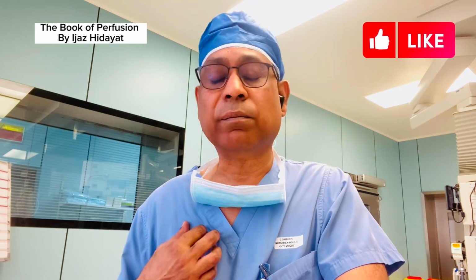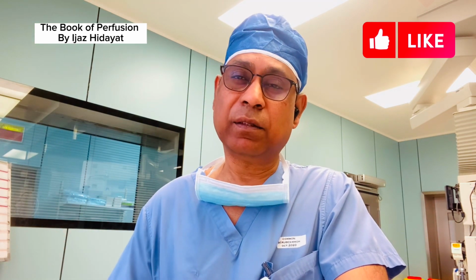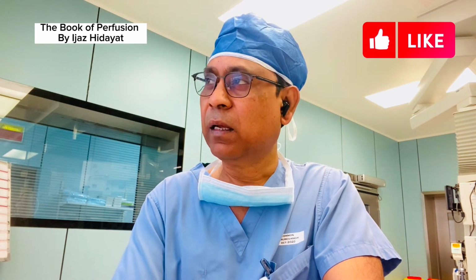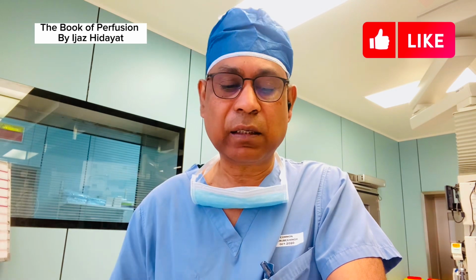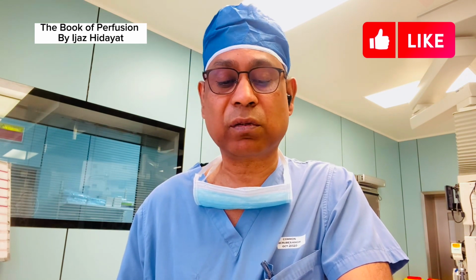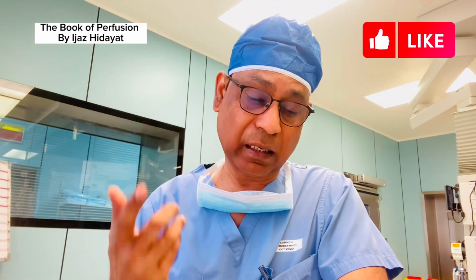During the bilateral PA clamping, once both PAs are clamped, try to keep the heart empty. This is one of the key points for the perfusionist, the time they clamp both PAs. So try to avoid distension of the heart. The second advice is, once they open the bronchus, try to turn off all your suckers to avoid getting secretions in your circuit.